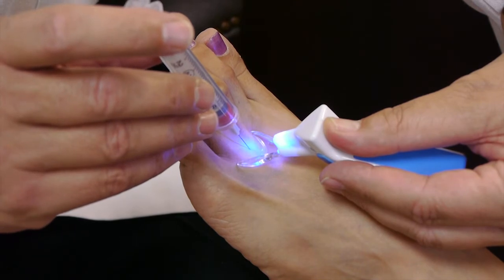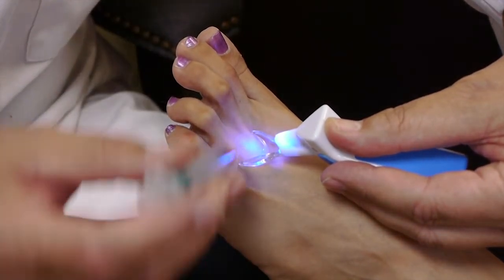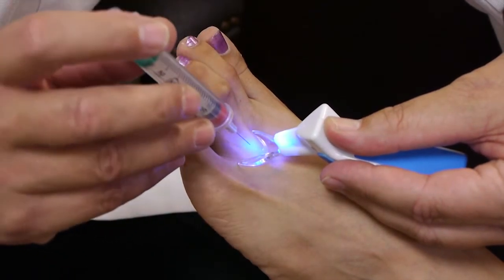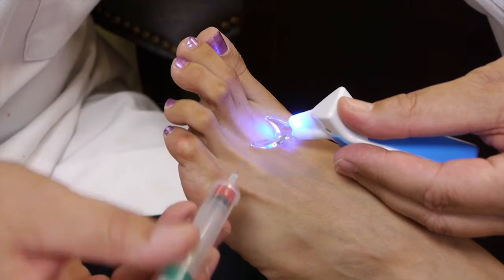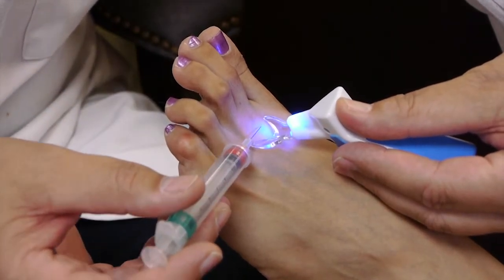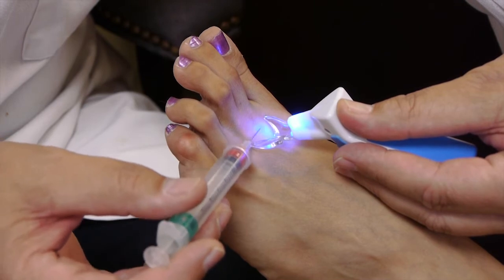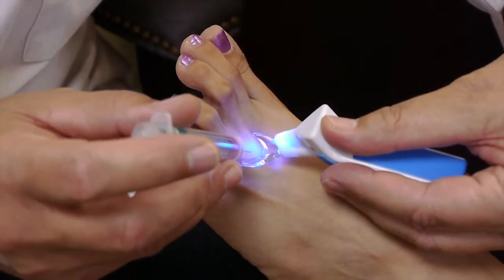and then the injection would go directly at the site of the needle itself. Occasionally people will fan the needle across when they do a neuroma, and in that case you would use the device right where the needle goes in, and then I actually move the device over where I'm going to push the needle where it ends up infiltrating the medication. And that way they don't feel the infiltration of the medication nearly as much. And so that would be for a neuroma.